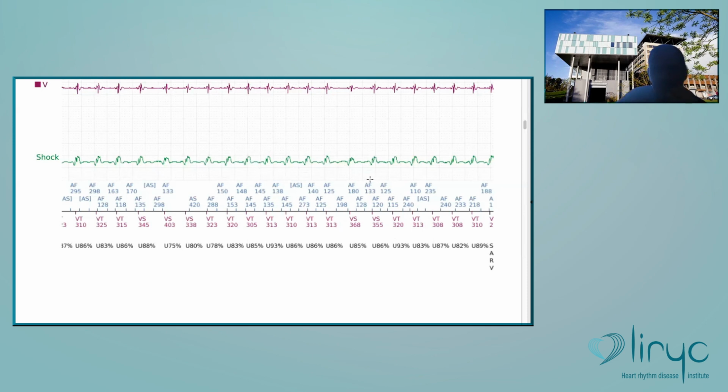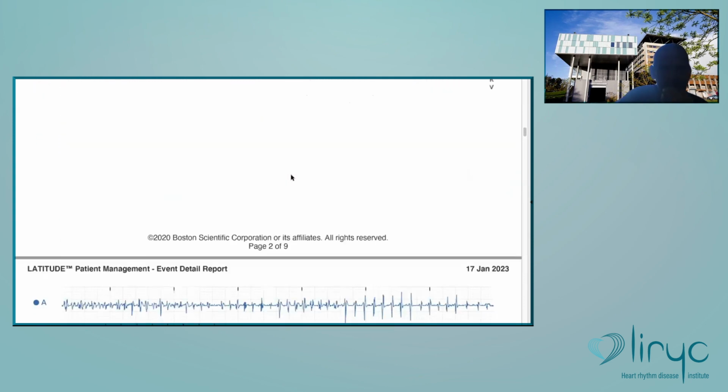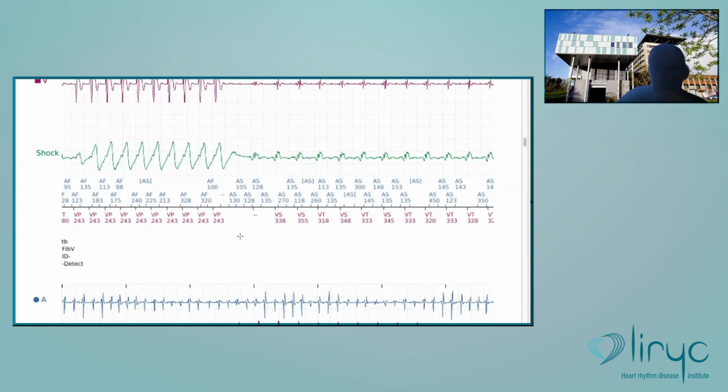So if you have these kind of problems, even if initially the rhythm is quite unstable, if at one time it becomes stable, then like here, the patient will be treated. And if it is treated, then you may receive many inappropriate therapies. Okay? Are there any questions?